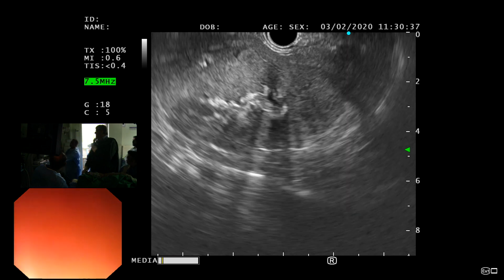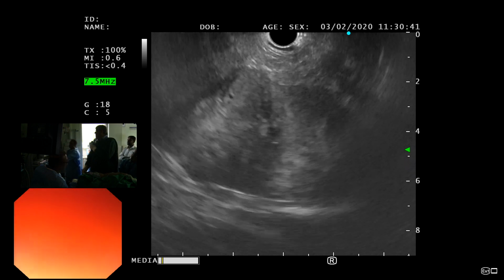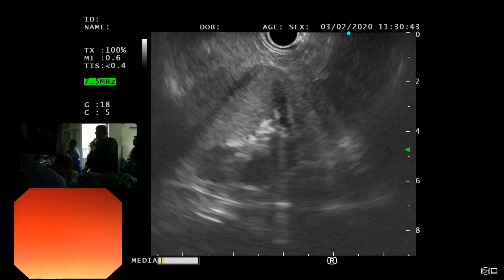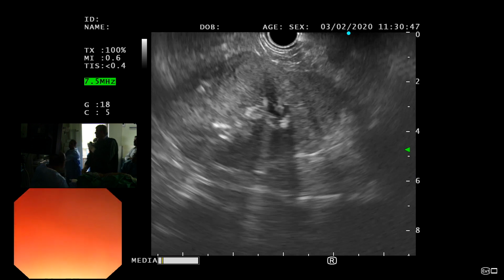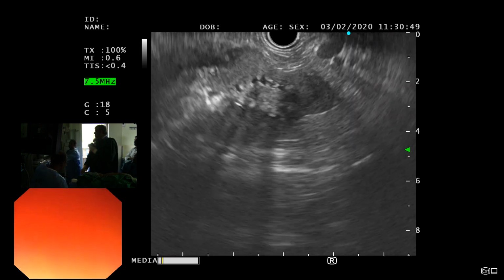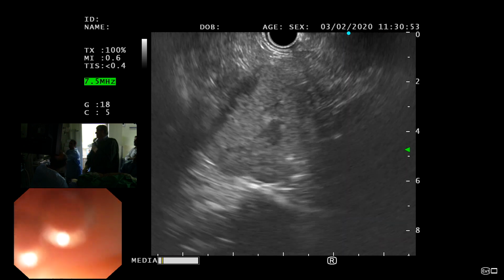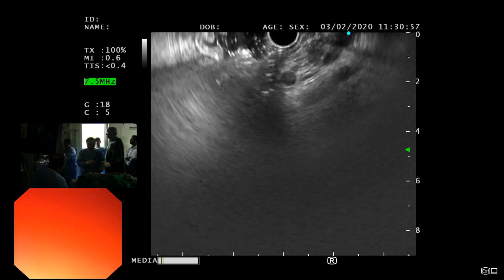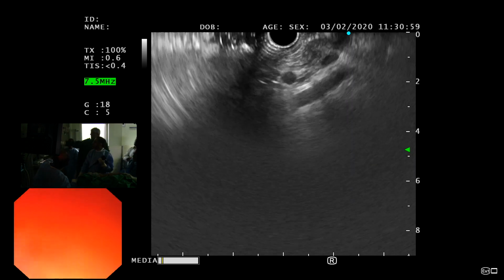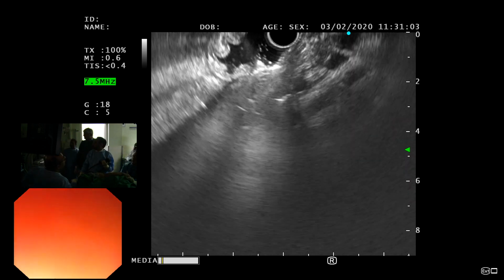We saw the left kidney and then spleen, but you can see there is no pancreas above it. Khalid, Rayas, can you see it? Yes, we can see that. Hello? Yes, yes, we can see you. And we can hear you. Really, there is nothing like a distal pancreas here. That's right. So we'll go out and see the head, which is our area of interest. There's a little bit of pancreas just now with the splenic vessels just there.